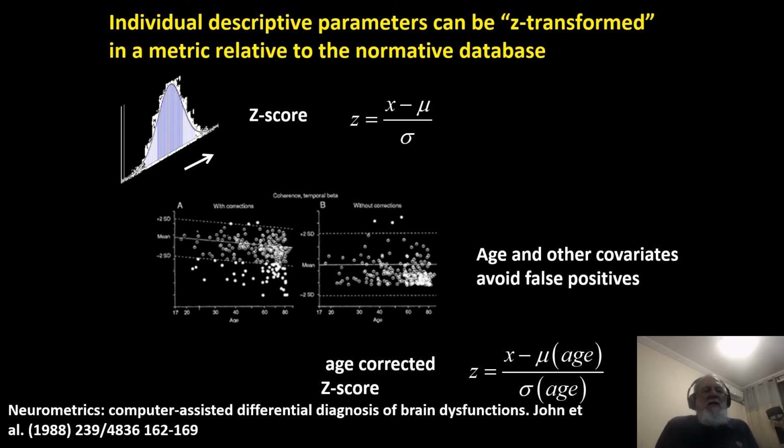So basically, we have been working since the 70s in looking at ways of measuring the deviation of individuals from specific norms. Basic to the central idea is the simple idea of a z-score, in which we subtract the population mean and divide by the standard deviation.